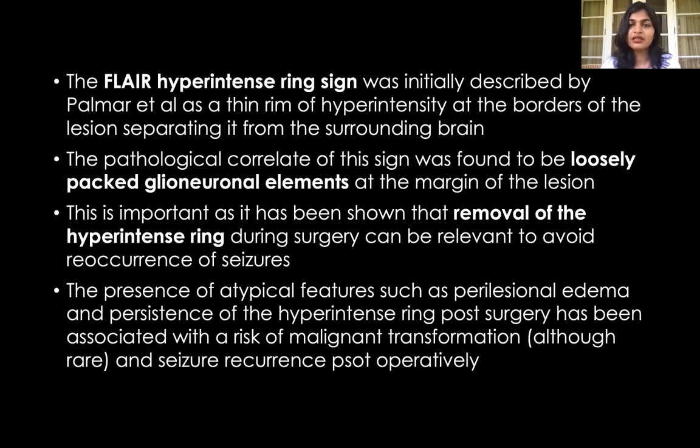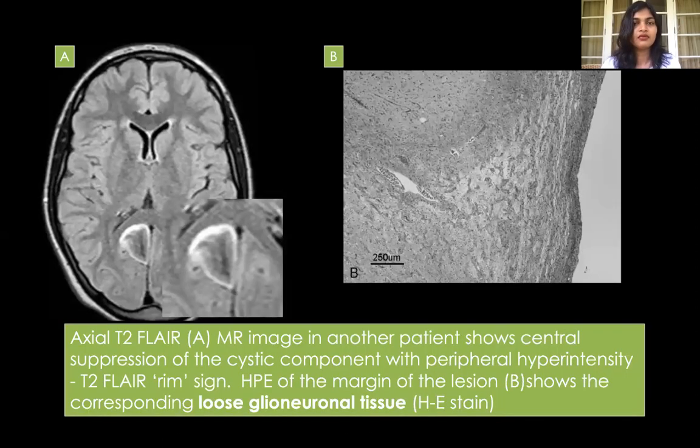The presence of atypical features such as perilesional edema and the persistence of the hyperintense ring post-surgery has been associated with the risk of malignant transformation and seizure recurrence post-operatively, although it is a rare occurrence.